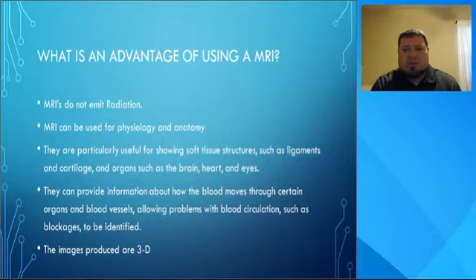Some of the big advantages to using an MRI is there's no radiation. They're currently coming out with a PET MR, which is good because if you have children that are sick and they need to be scanned, you're not putting them in something with radiation, or you're limiting the radiation. PET MR does use radiation on the PET side, but if you need to get a scan and you're worried about the patient being in contact with radiation and emitting beams, then you would definitely want to get an MRI.